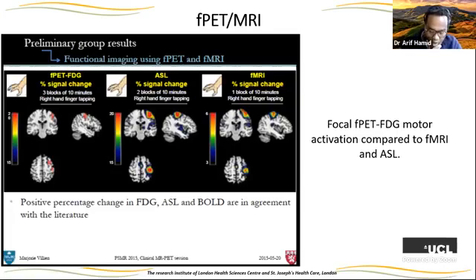I just want to follow up on this SNR versus temporal resolution question that you had. I'm curious if the field is also considering increasing local resolution by doing the magnetization at a common artery to just a very specific local area.